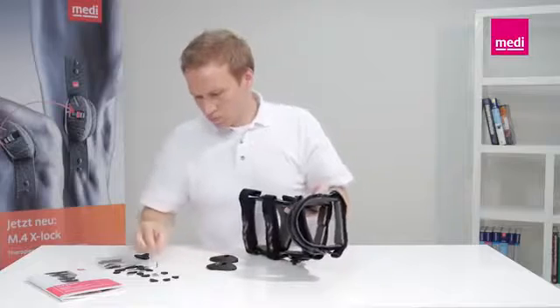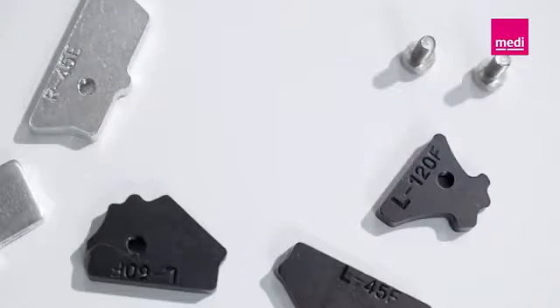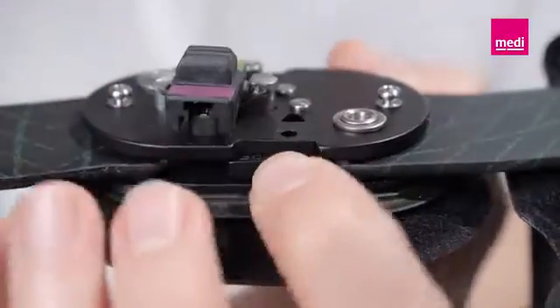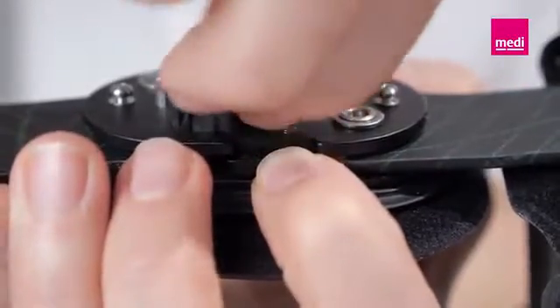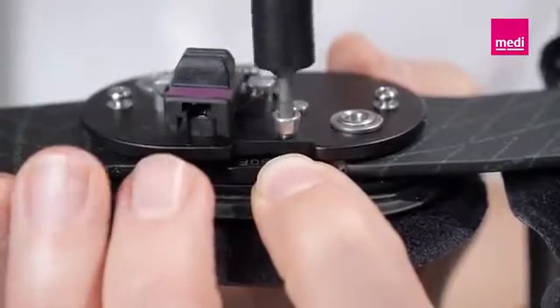However, other extension wedges can be used if needed. You will find the replacement wedges in the wedge set. The engraved description helps you find the correct wedge. Slide the new black flexion wedges into the hinge from the back. Insert the wedges so that the letter, which is also shown on the underside of the respective hinge cover, is facing upward, right or left.